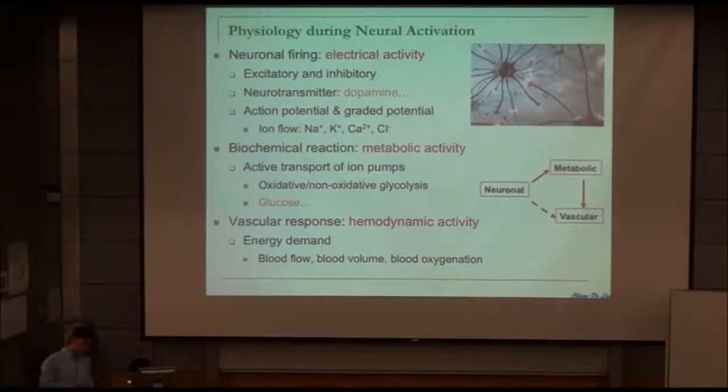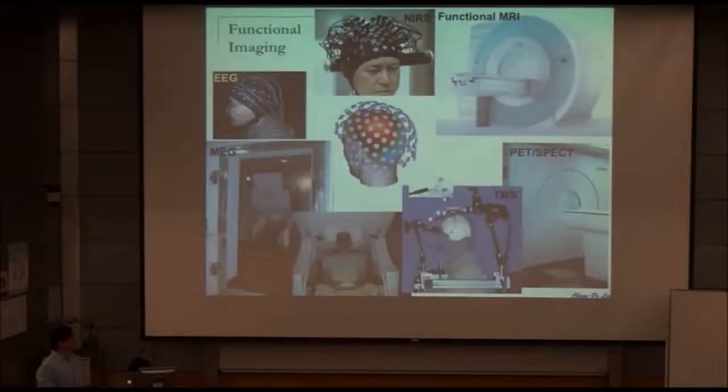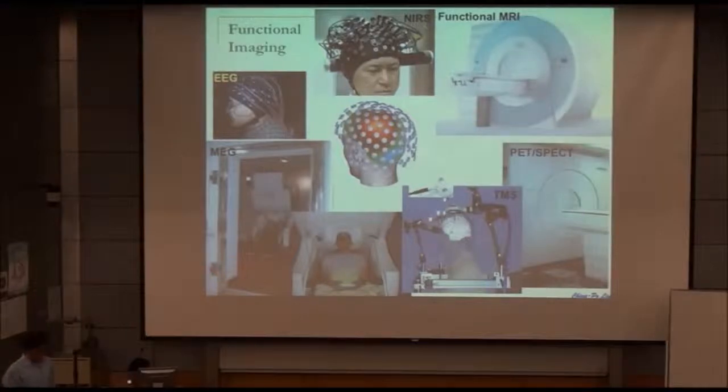So the basic idea for us is that no matter what kind of information you detect, that means the area has brain function. And of course, as I introduced to you, we must have such kinds of non-invasive measurement. Nowadays there are a lot of techniques. I just summarize here. There are techniques that we can use to measure the electrical signal. They are very simple and easy to use.